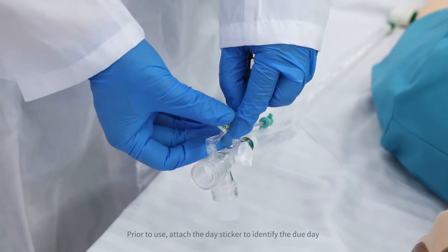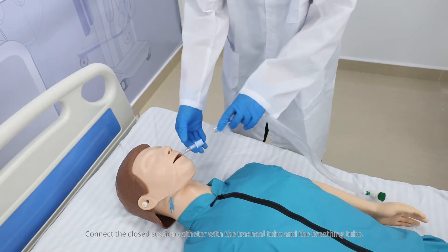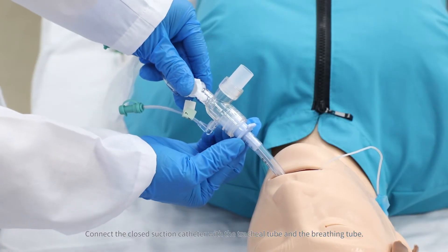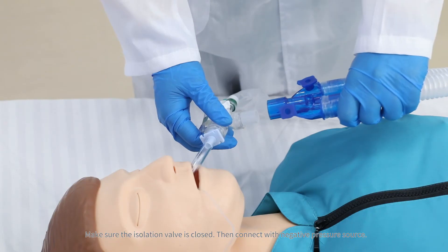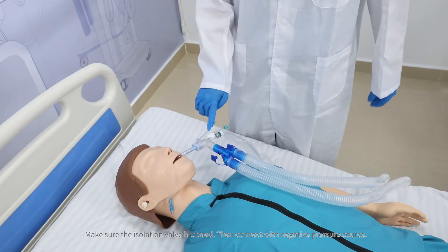Prior to use, attach the day sticker to identify the due day. Connect the close suction catheter with the tracheal tube and the breathing tube. Make sure the isolation valve is closed, then connect with the negative pressure source.